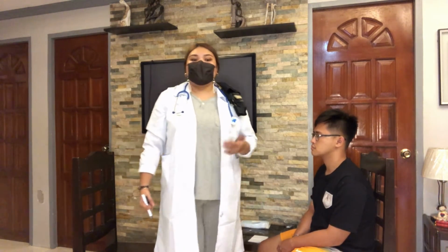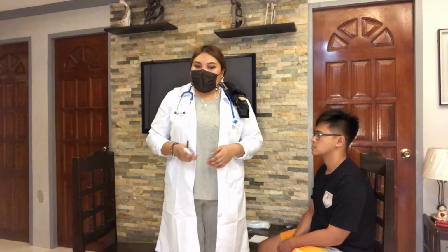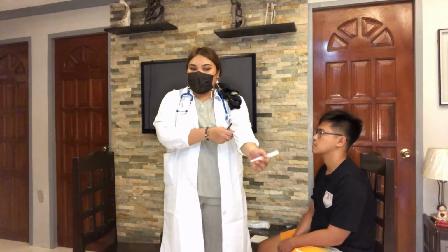Then we would allow the patient to take a quick rest so that pressure on the nostril will be prevented. Then take note that the nasal speculum should be inserted about 1 centimeter, or up to the point where the blade widens, and we will also determine any redness, swelling, and abnormalities in the appearance of the nostril.